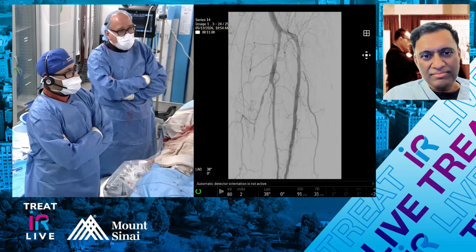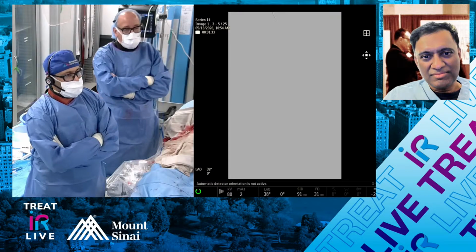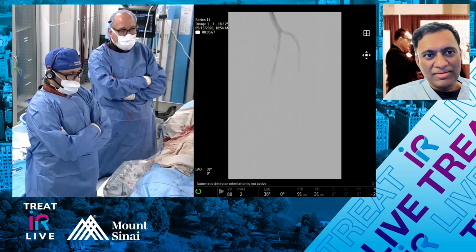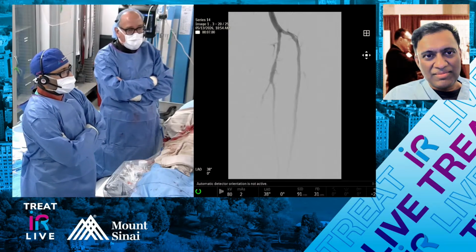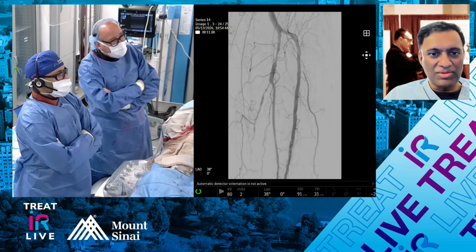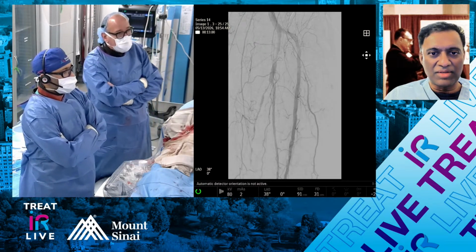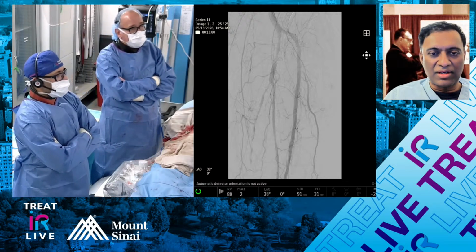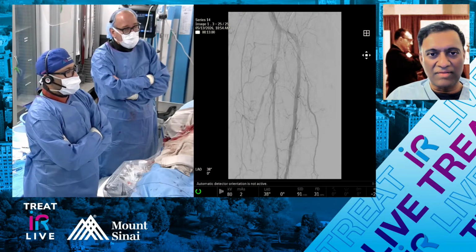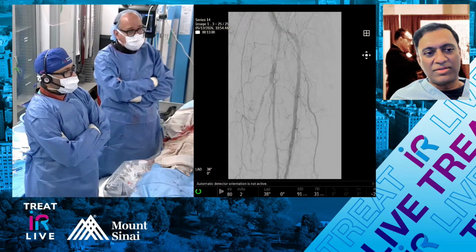But I personally want to thank you for all your help and guidance for the last hour over this case. Do you have any closing comments or questions before I let you go and wrap up? No, I think it's a great case, showcasing the importance of IVUS, modifying technology, and a new kind of drug-eluting absorbable scaffold. Well done, and very important for trainees to learn this in residency and fellowships. All right, thanks so much.